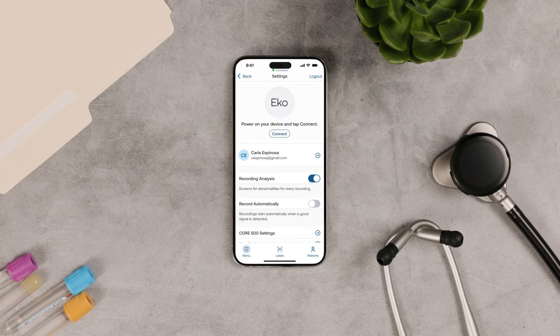Open the Echo app and make sure the Core 500 is connected. If you want recordings to start automatically, make sure the Record Automatically setting is on.